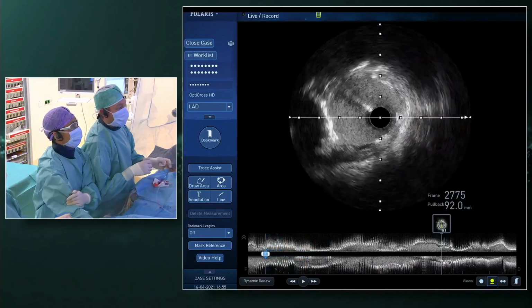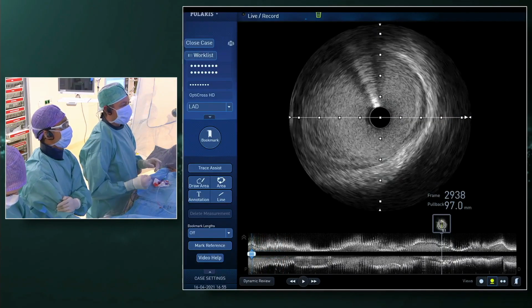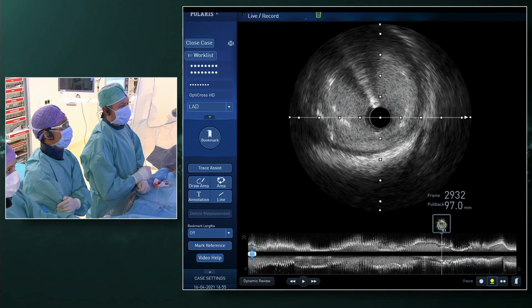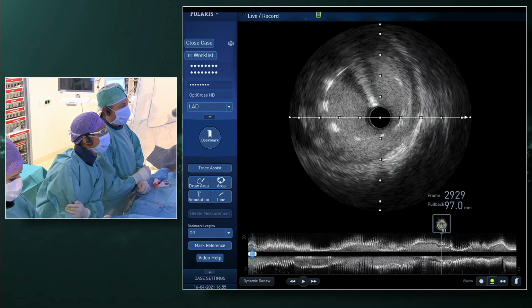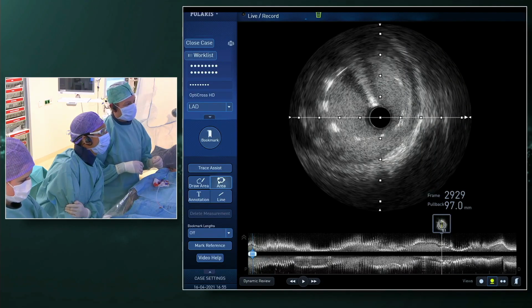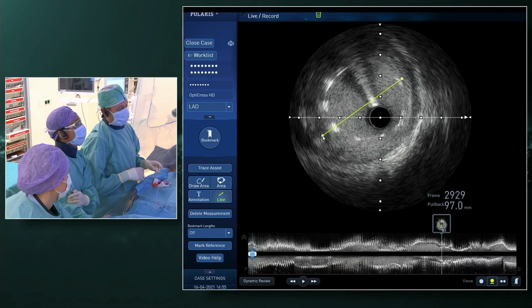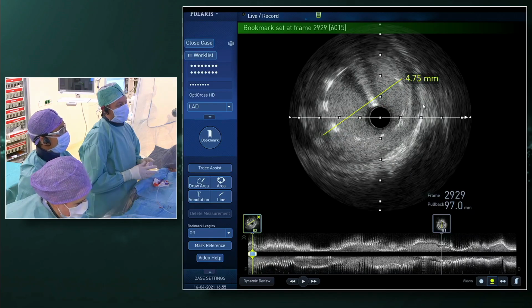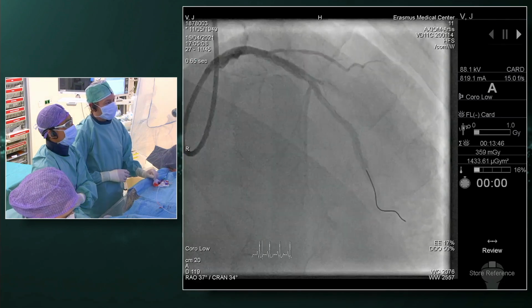Only thing, it came a little bit more proximal than maybe intended, and we ended up here in the left main stem, which was, as you said already, huge compared to the rest. And for that, you need a sort of POT of 4.75. So maybe we can quickly show the angiogram before we lose connection.